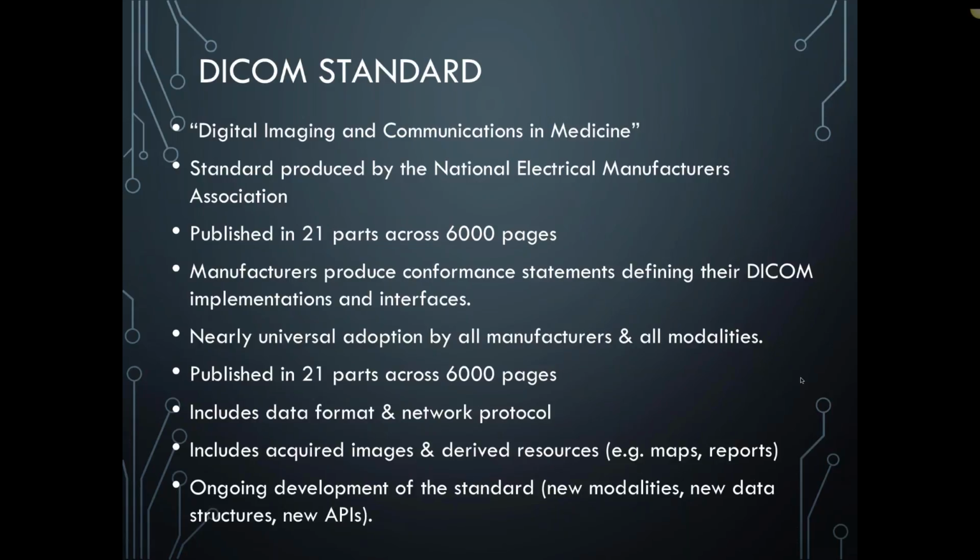One of the nice things about DICOM is that it really is a standard in that it's been universally adopted by virtually all manufacturers and for all modalities used in the clinic. Interestingly, the standard includes a definition and specification of both the data format, so how the images are stored, as well as the network protocol for communicating those images between systems. It includes both the acquired images as well as various kinds of derived resources.